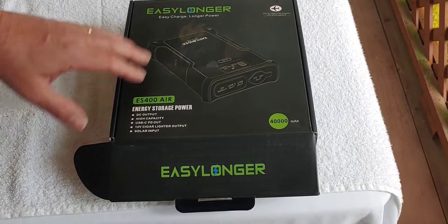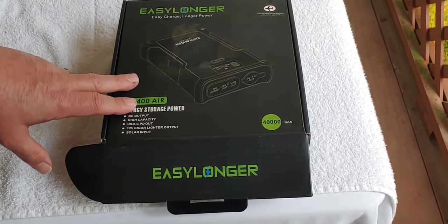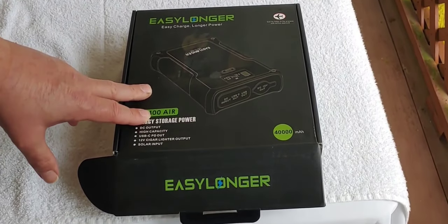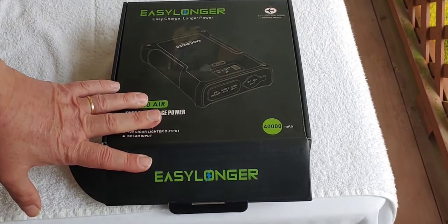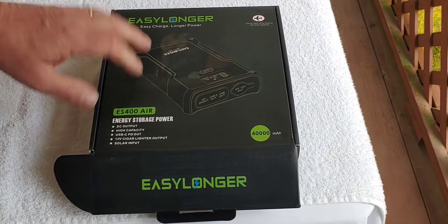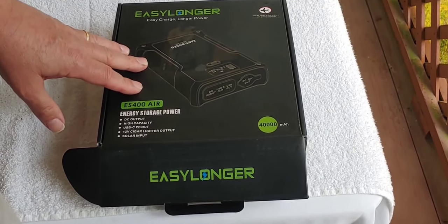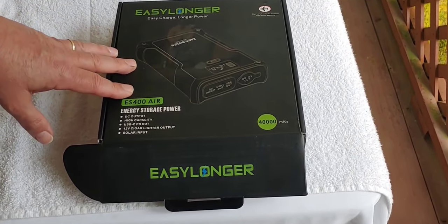I'm doing these videos on these power supplies because they're DC and not AC. It's not like a battery where you have to have an inverter. These right here are nice and quiet and they go directly from DC to DC, and I like that. They're real valuable when you're having a power outage, you're out camping, or just something happens.